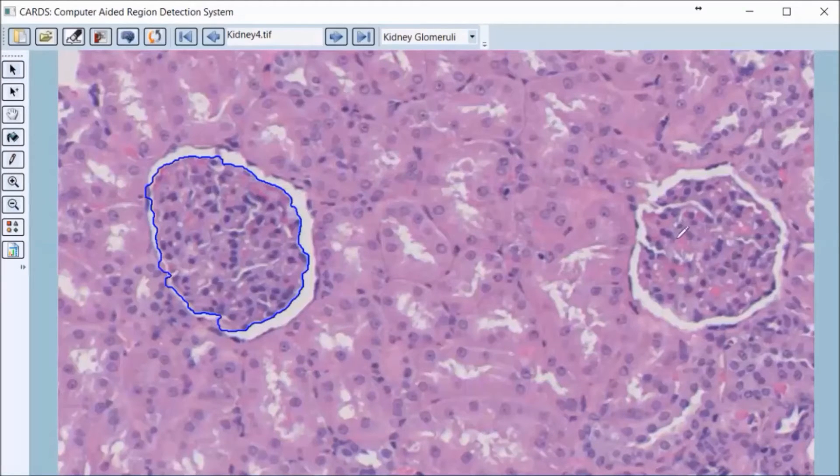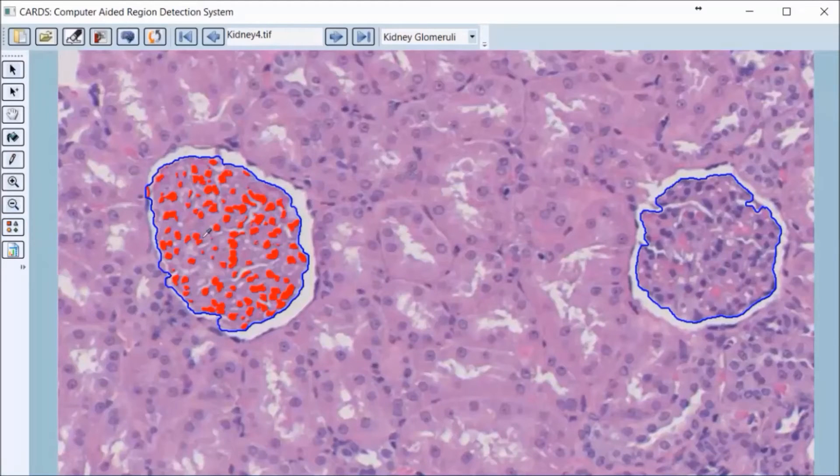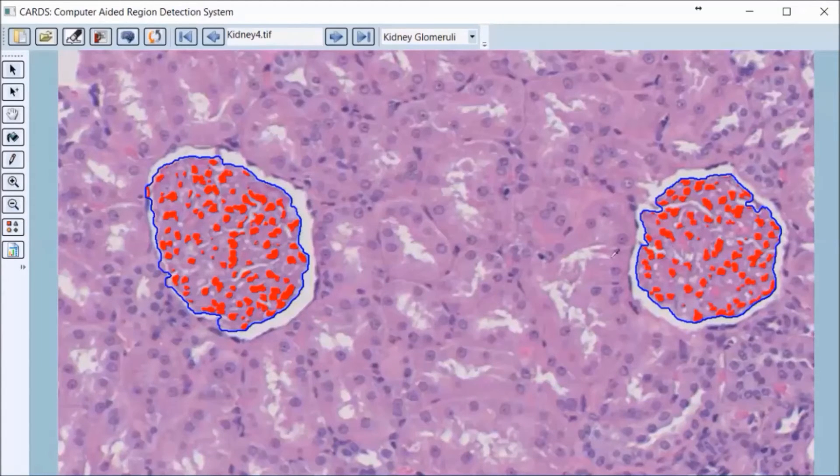Our cellular detection tool for this image highlights the epithelial cells which could aid pathologists to test renal failure.